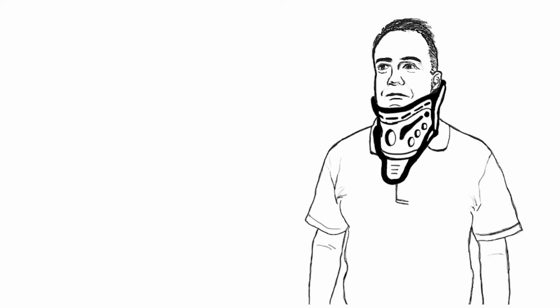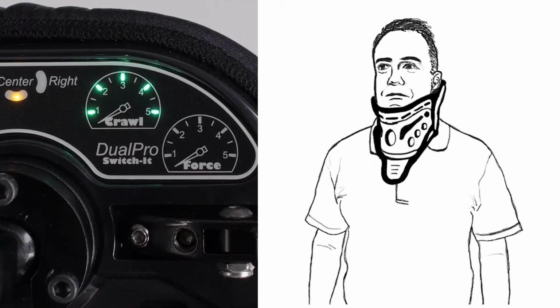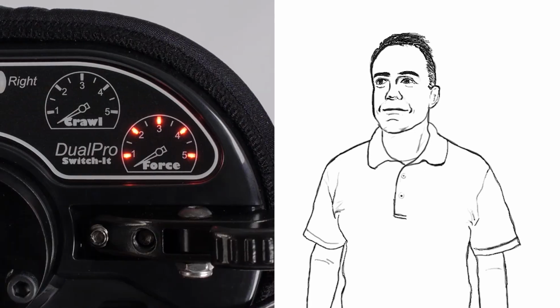Conversely, a spinal cord injury client may have a cervical collar which limits their range, requiring they start off using a full proximity setting. When the collar is removed and they gain range and strength, they would then be able to switch to a proportional setting through force, again without changing equipment.